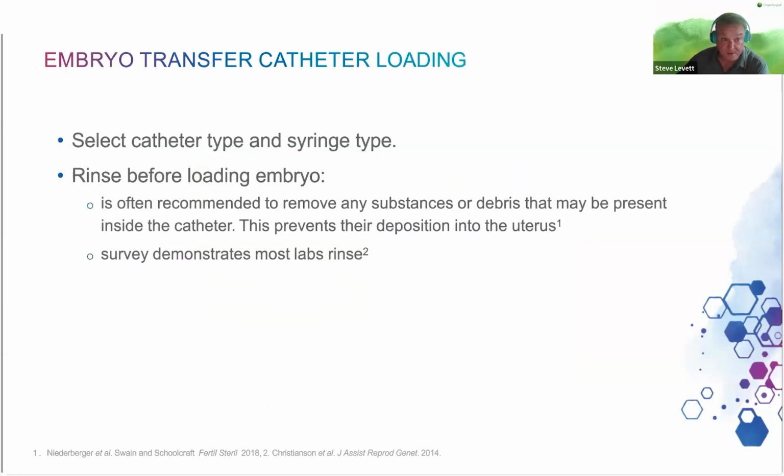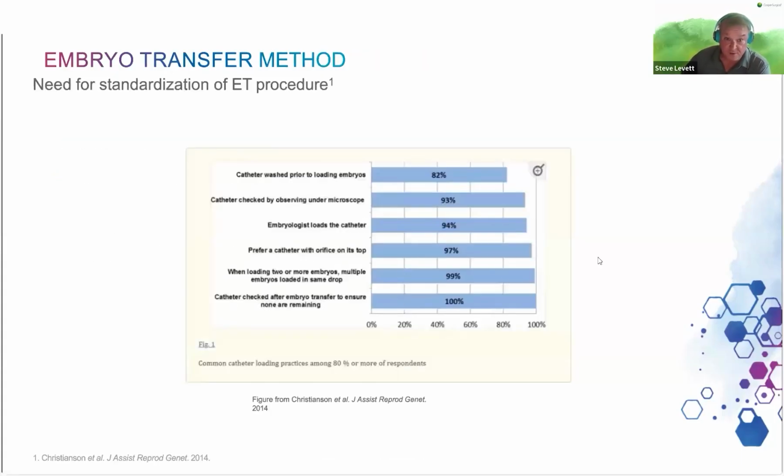So the type of catheter and the syringe, there needs to be a discussion on which to use. And it is recommended that we rinse the catheter before loading. But if you look on this one, most do, but there's still 18% here that don't.